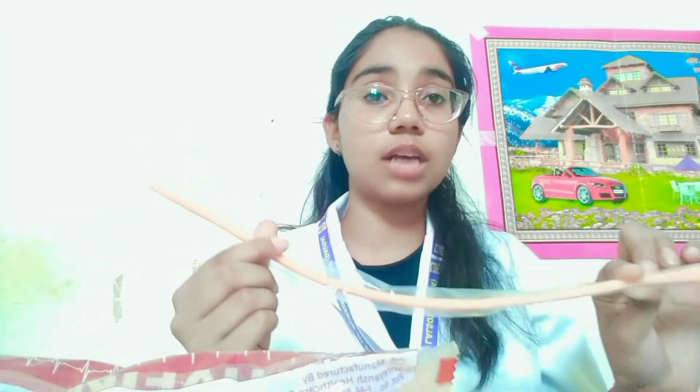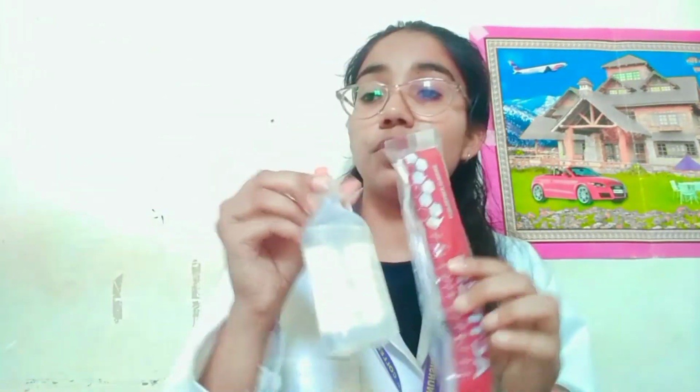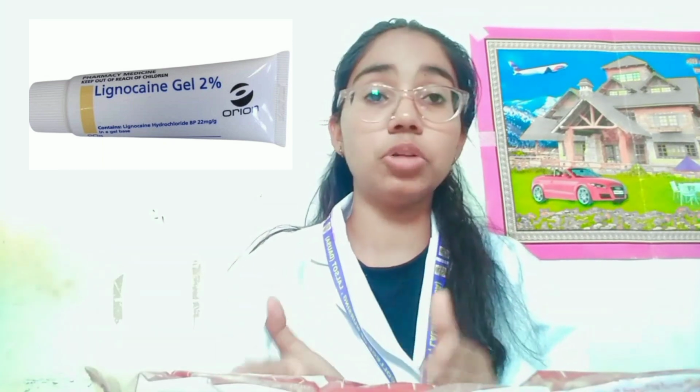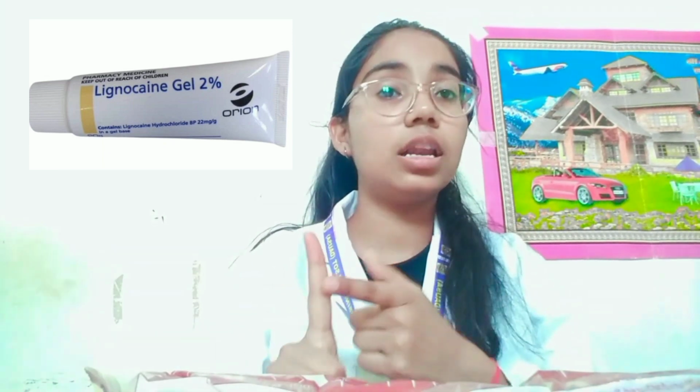There are many equipments used in urinary catheterization. First of all, we prepare a tray which contains a sterile urinary catheter of appropriate size according to the patient. This catheter is used to relieve urinary distension. The second one is the PPE kit, gloves, mask, apron to prevent transmission of infection. The third one is a 10 cc syringe and sterile water to inflate the balloon, and then lubricant jelly to lubricate the catheter, which prevents any irritation or injury. Example, xylocaine jelly, lidocaine jelly.